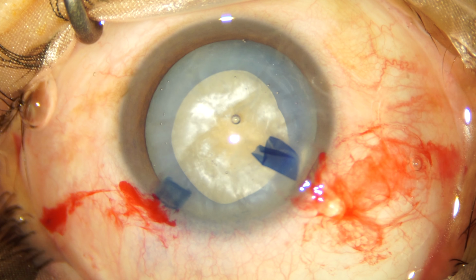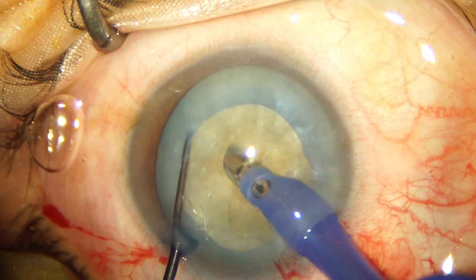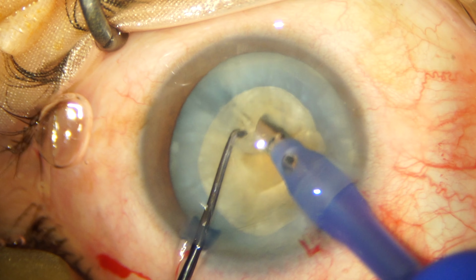Mature cataracts generally rotate freely and do not require hydrodissection procedures, and we go ahead with the direct chop technique for the nuclear fracture of this mature cataract, and we are successful in cracking the nucleus into two heminuclei.